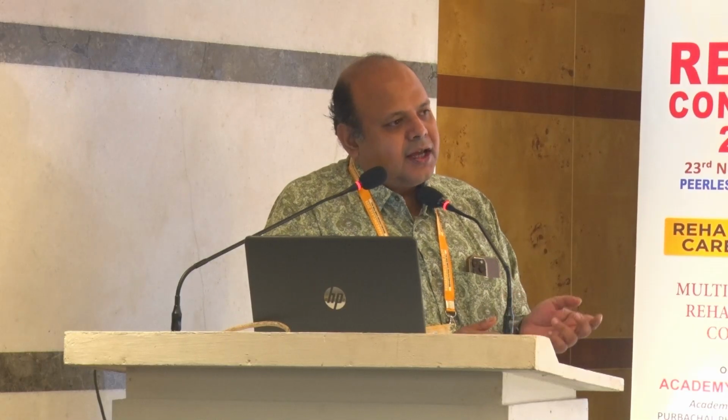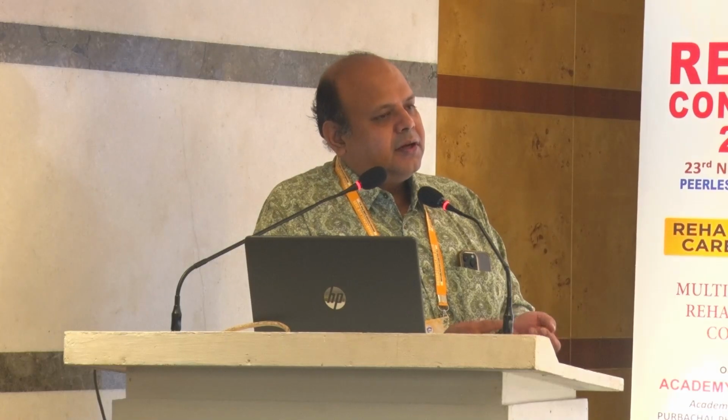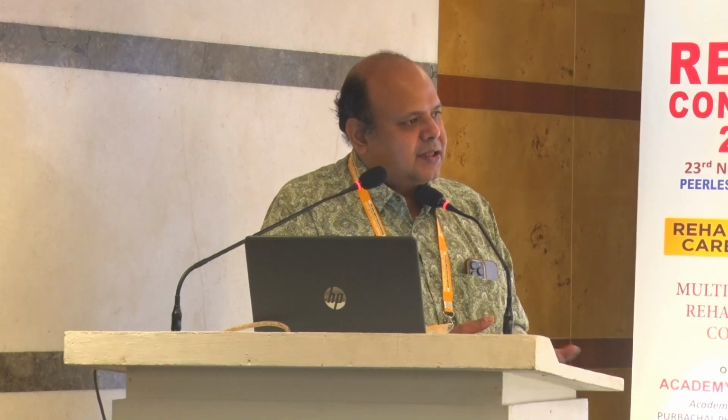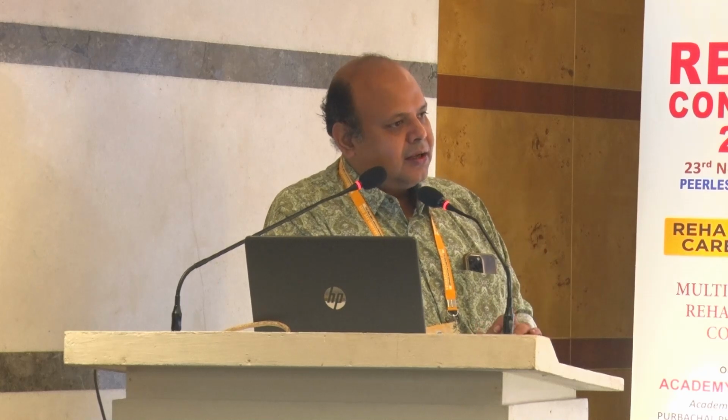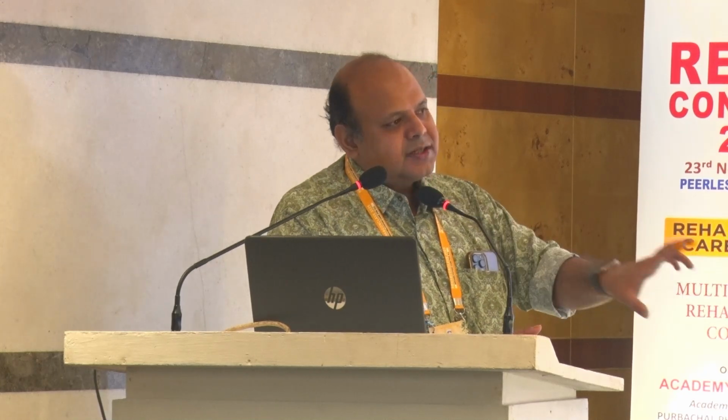The only thing is, to rule out a partial tear, you always have to strain the tendon. If it is a biceps tendon, you ask the patient to flex the arm, and you put your transducer at the myotendinous and the osteotendinous junction. You see the contour deformity. If it is homogeneously contracting, that means there is no tear per se in the muscle.